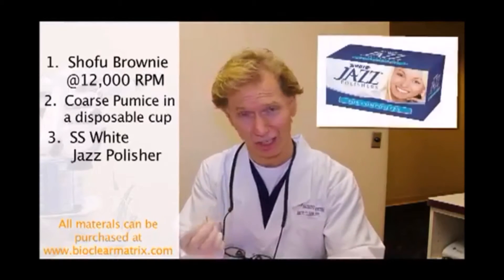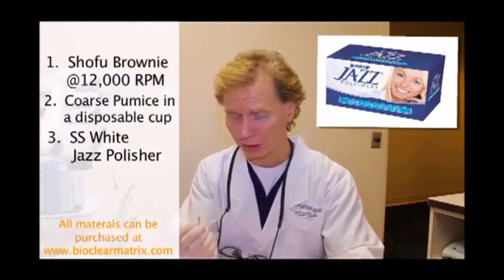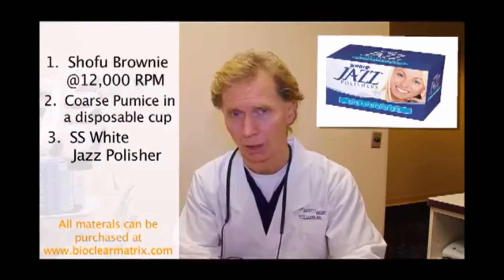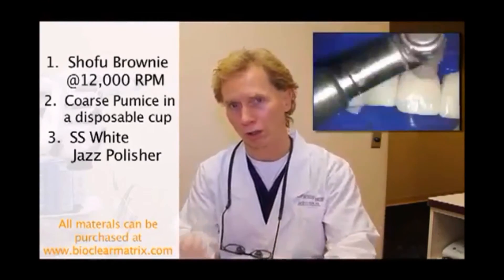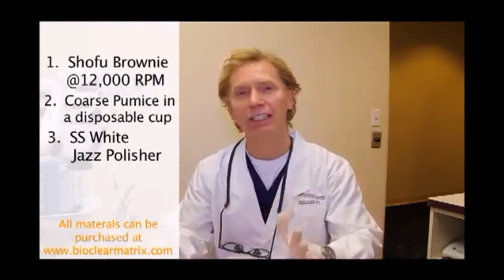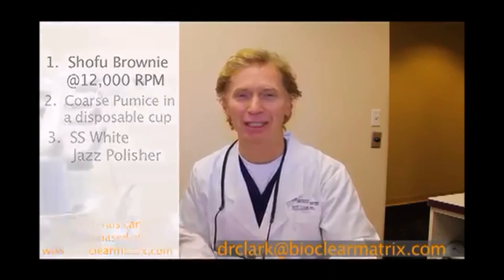We spend more time with the jazz polisher. This is diamond-impregnated — they're about $10, so make sure nobody throws these away. We're going to use heavy pressure with this jazz polisher, constant water, and constantly moving the cup so we don't burn a hole. You should get a beautiful, moving, living, incredibly smooth finish with these three steps. If you have any questions, send me an email. Thanks.